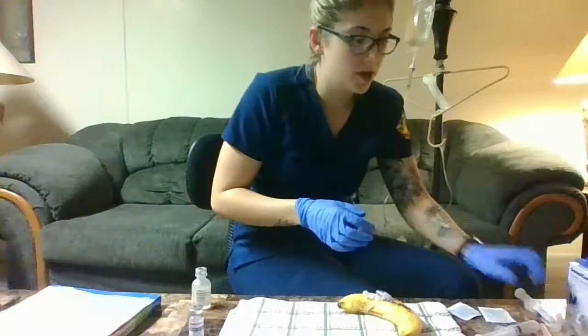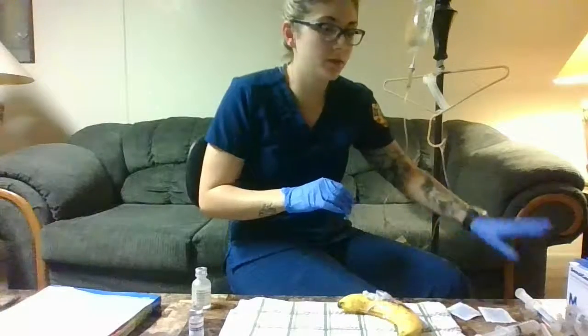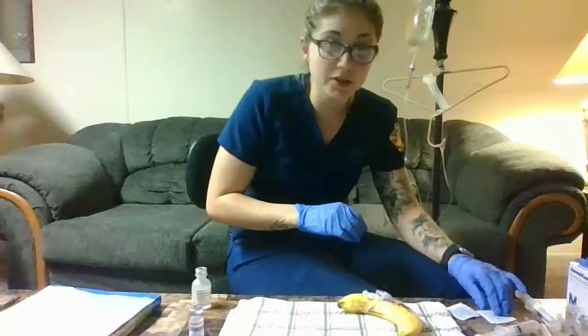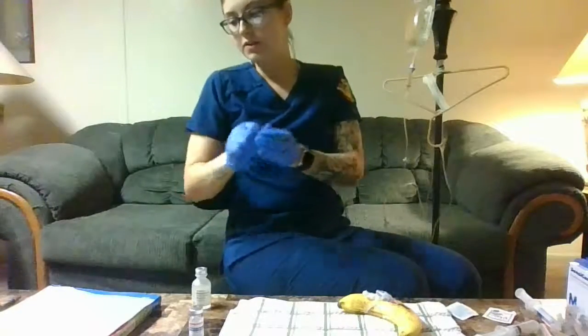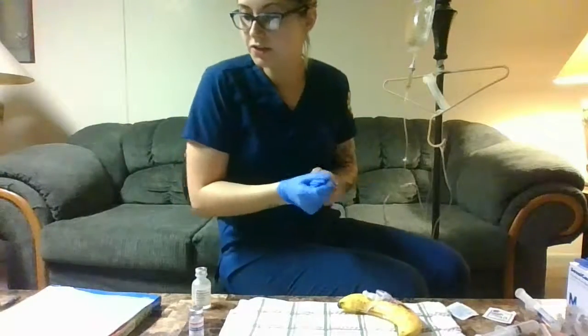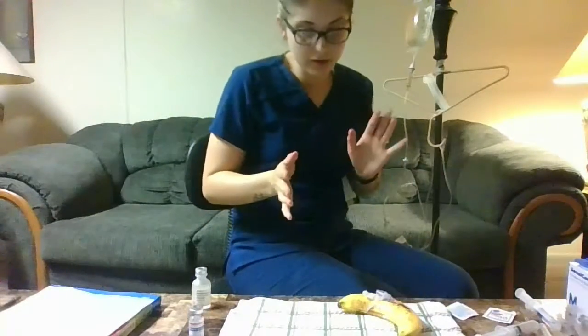You're going to put away all your equipment, so the needles in the sharps bin. Throw away all your garbage, get that out of the way. You can clean the port again after you're done using it. And then you're going to document that you gave the medication, that they tolerated it well, that the IV site looked good, no complaints there. And then make sure that you go back and reassess their pain. Leave them with their call light, ask them if they have any questions. Make sure they're safe.